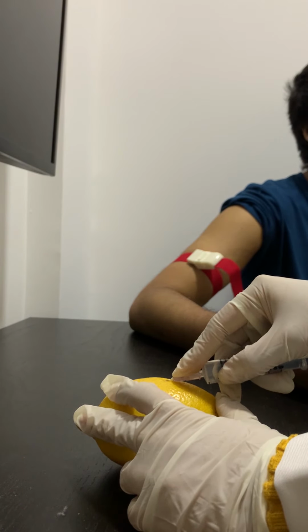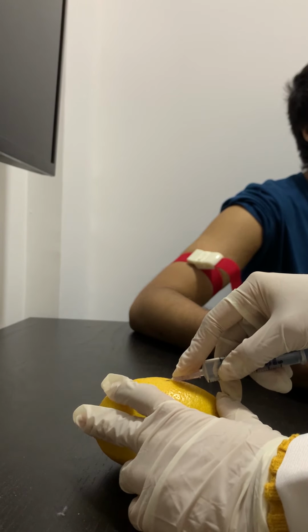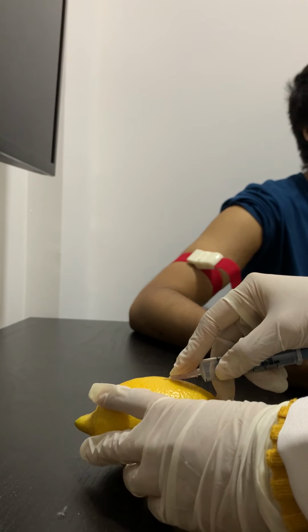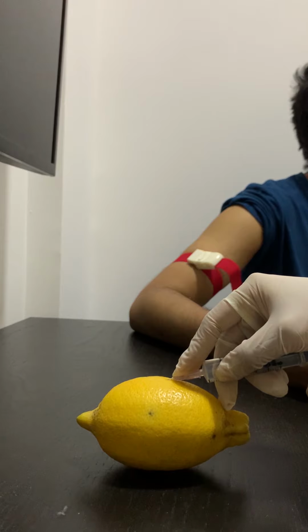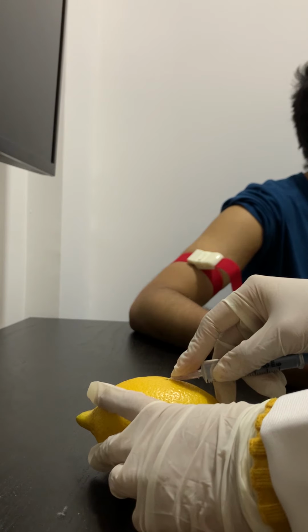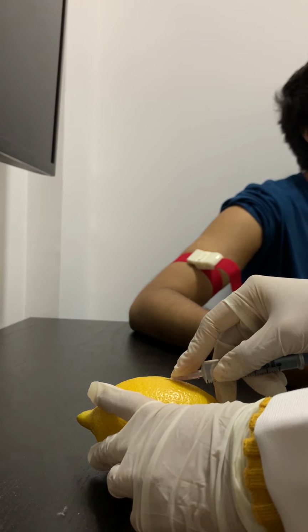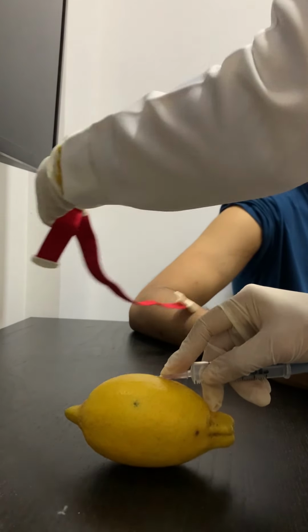Once we fix it at this position, we can pull back on the plunger to see if it has hit the vein. If so, we can see blood in the aspiration. If it is positive, now we may release the tourniquet by simply pressing on the clip and the button.